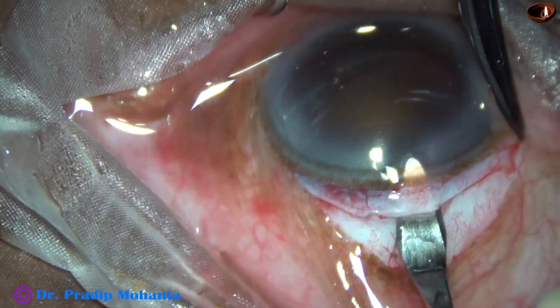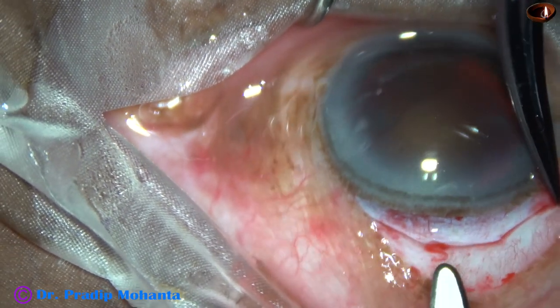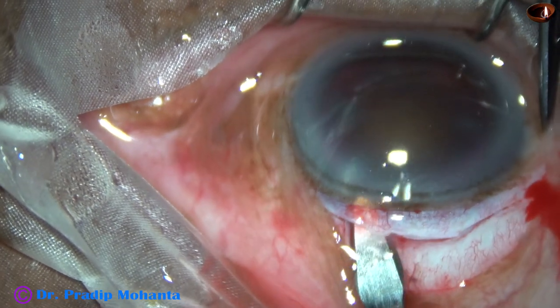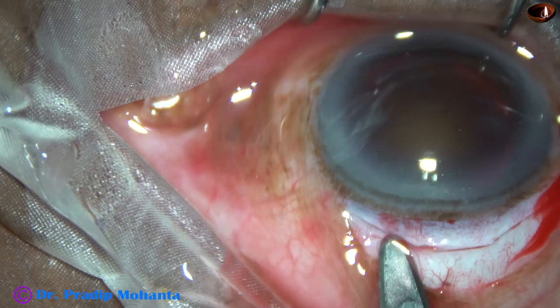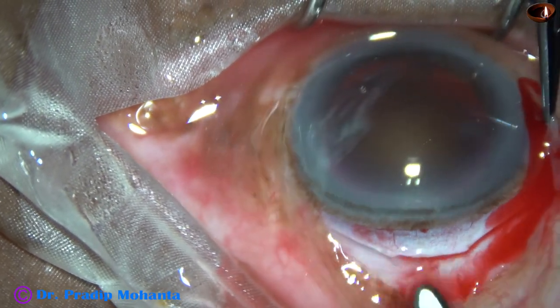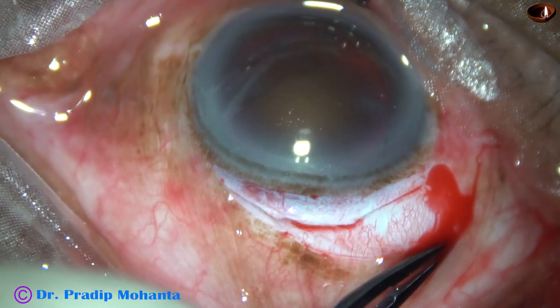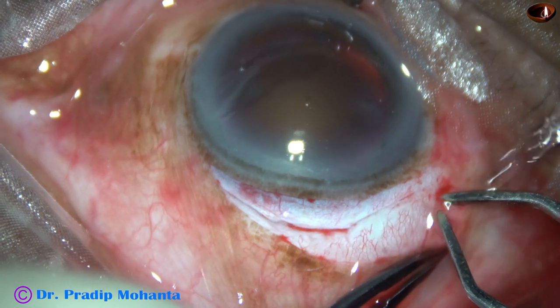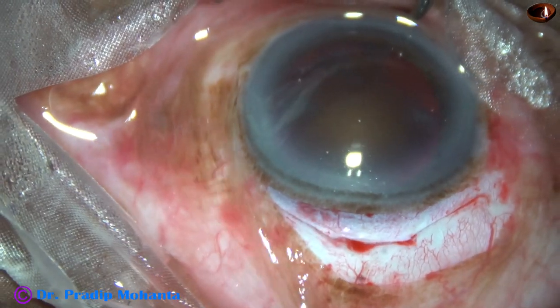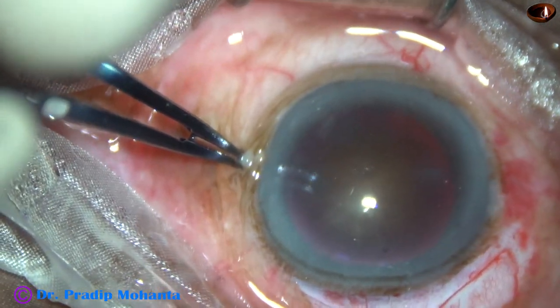I am holding the sclera or conjunctiva tenons very gently so that I don't cause any laceration of the wound. Now see what has happened — as I held the corner of the wound, bleeding has started. Probably this is arterial and we have to cauterize it to get a clean surgery. So I ask for the cautery again and just one touch will be enough. If we do wet-field cautery, the surgery looks neat and clean and it is very much helpful to beginners.